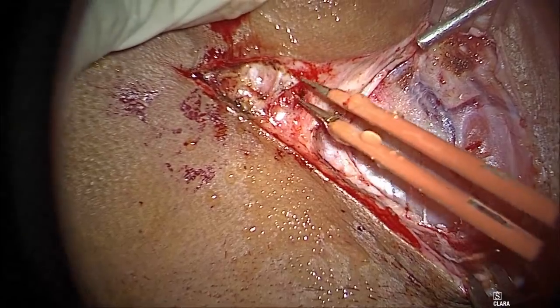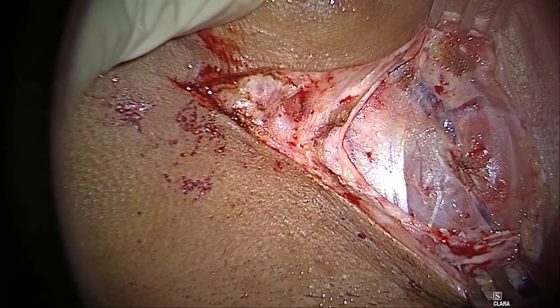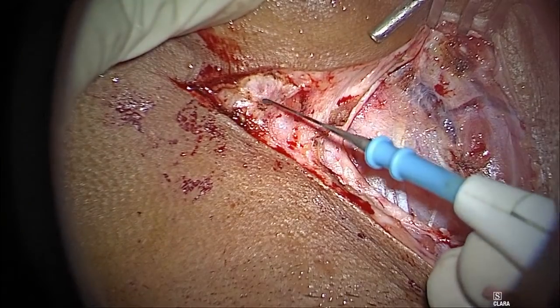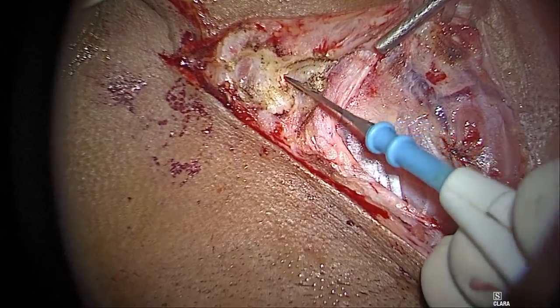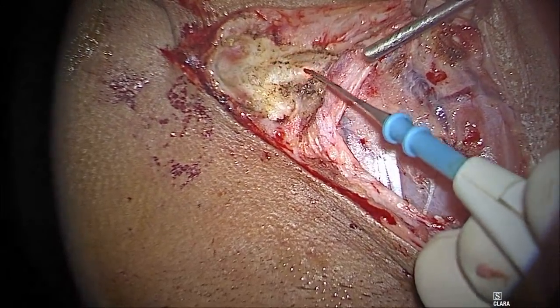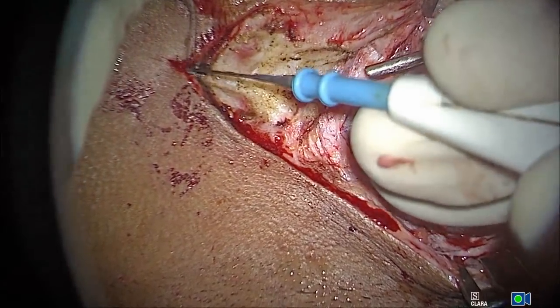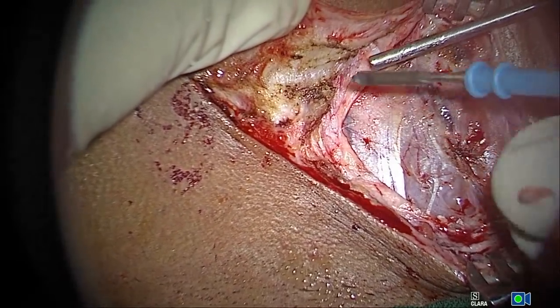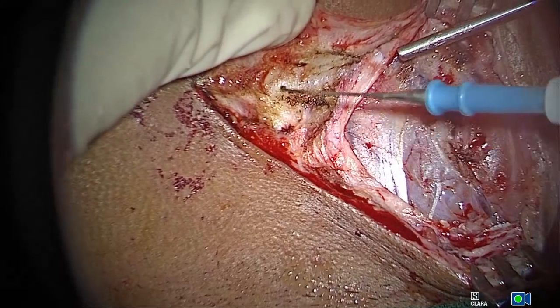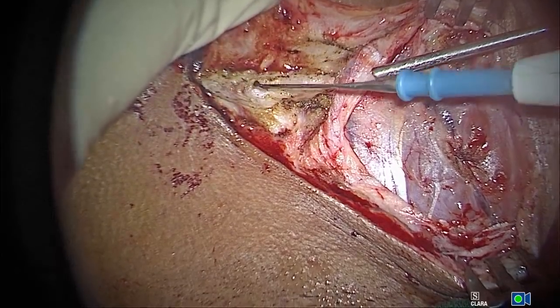Okay, and that's actually the greater auricular now. I actually cut it, but we can preserve it. Diathermy. Use of diathermy doesn't affect the paresthesia or anything, but it definitely affects wound healing. But it is bloodless. During surgery it looks absolutely bloodless. And so we routinely use monopolar.